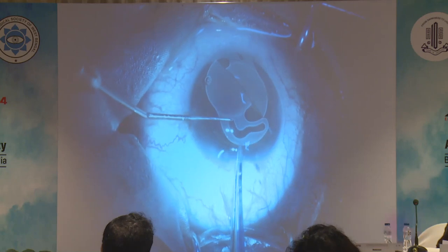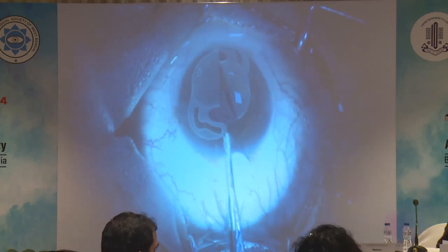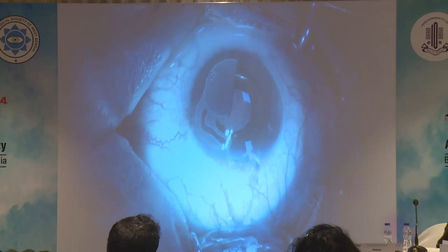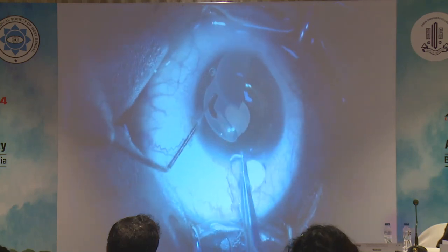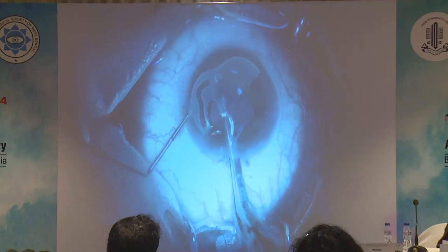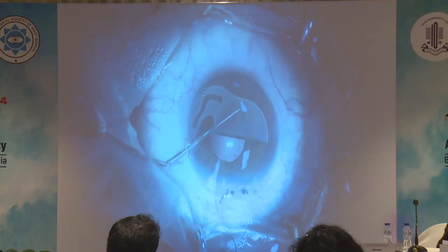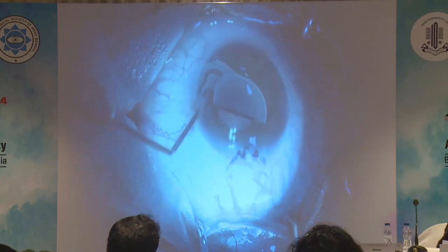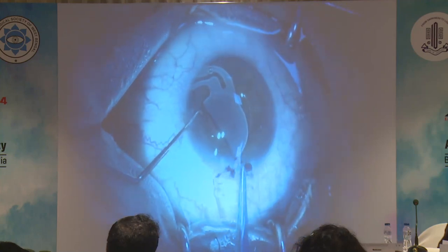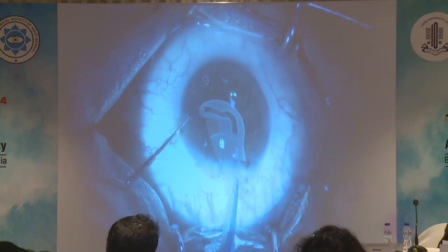I use lens holding forceps to remove the cut pieces of the opacified IOL. I try to catch the proximal half, but I am not able to do so. So I plan to catch the distal one and gently take it out. Then I realign the other piece along the main port, and gently take it out.